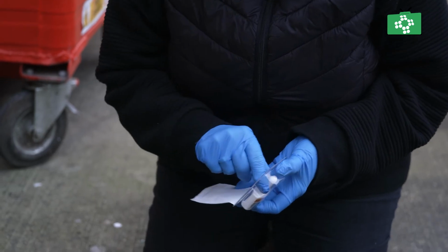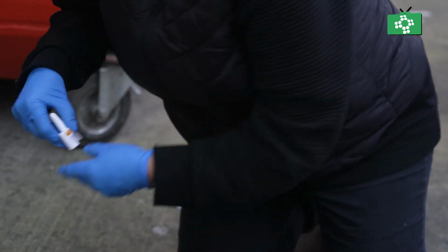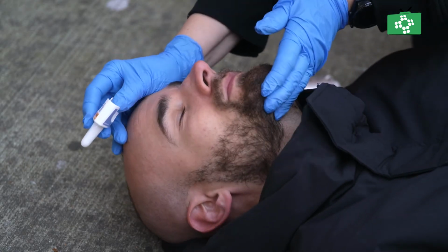First of all, remove the outer packaging and keep the nasal sprays close by. Then make sure that the person is laying on their back so that you can open their airway via the head tilt chin lift procedure. Check their nose to make sure there's nothing that will block the entry of the nasal spray.